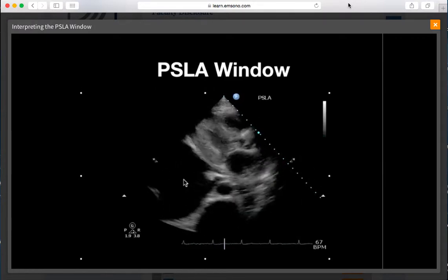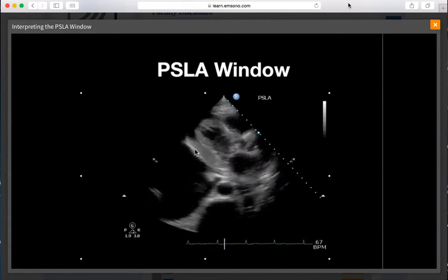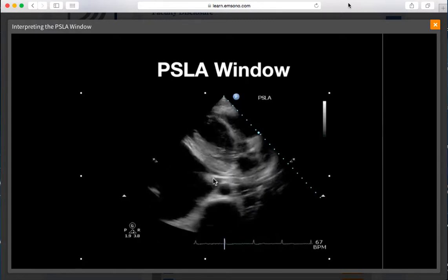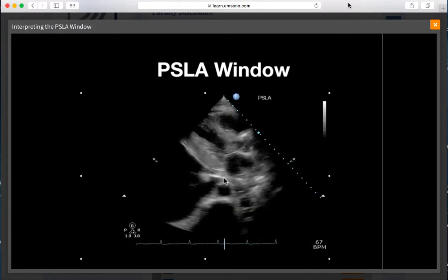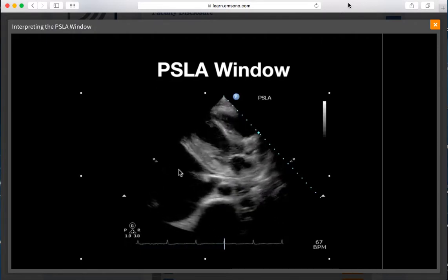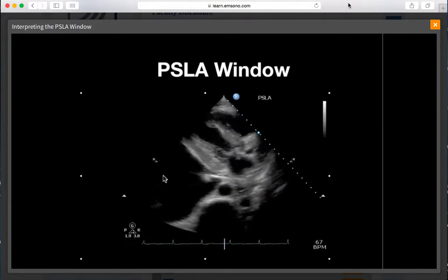In this video, the first thing you notice is that the patient has a very large anechoic fluid collection posterior to the left ventricle. However, as you follow it towards the descending aorta, you can see that it stops right at this point here. It does not pass anterior and extend towards the AV groove. So this large fluid collection represents a left pleural effusion.